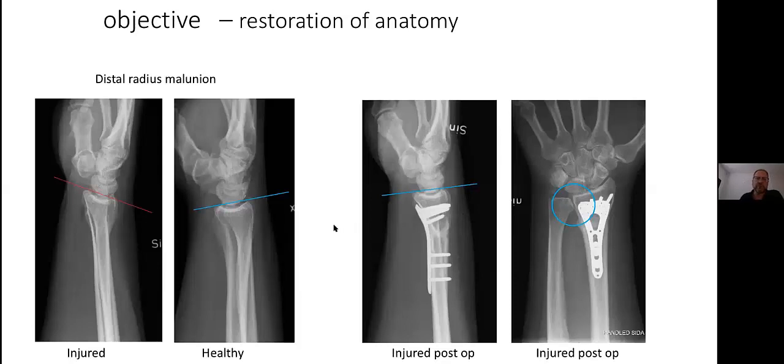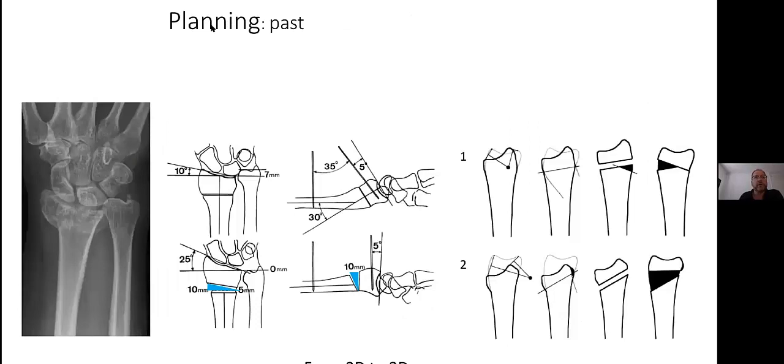I know Einar showed some models of the heart and so on. Of course, then it's very interesting to see how the interior, how the cavity looks. But for me, as a limb surgeon, orthopedic surgeon, it's mostly the geometry and the anatomy. I want to recreate the surface anatomy and the joints. Of course, we want to see and understand that these screws have some purchase, they get a grip in the bone, but mostly it's the exterior. So this was in the past.